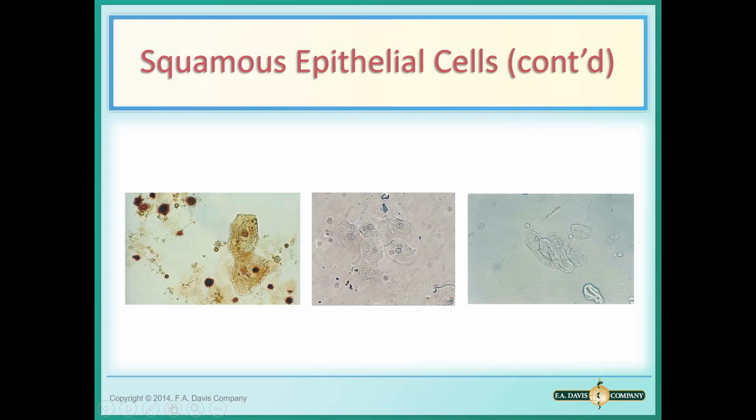This large clump of epithelial cells. Sometimes you see them in a sheet or a clump. We call that syncytia, and I'll point that word out to you on another slide. I can write it down. Syncytia means a clump or a cluster of cells.